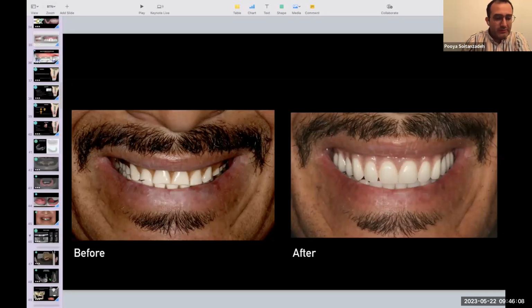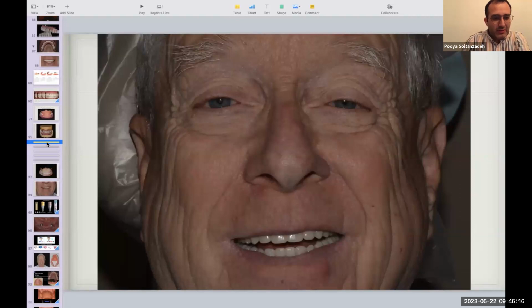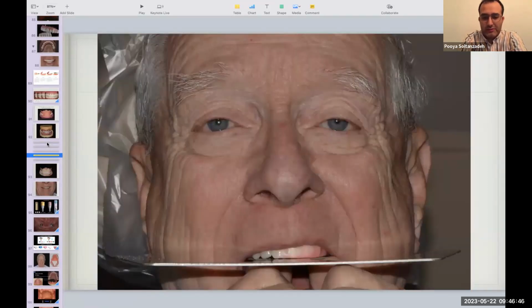You know what? Let me just very quickly show that case. Okay. For example, this patient came and I made the digital denture, but if you look at it, the occlusal plane is off. When you put that, it's not parallel to the interpupillary line, and it's not good, right? So what could be done is I added wax to that trial denture that I received from the company, and I made it right. So now it's all good.